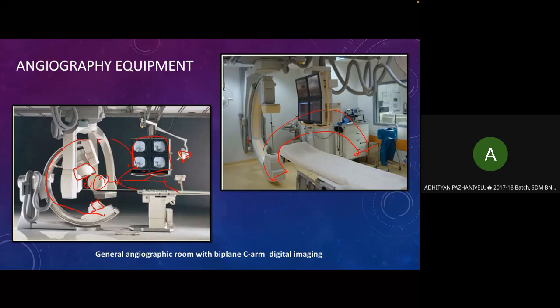Yes, sir. We have to take some protective measure. Which metal do you think is a good blocker of X-rays? Anybody have any general idea on this? Lead, sir. Yeah, lead. So ideally, I should wear a lead apron.